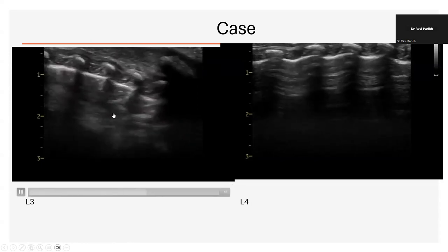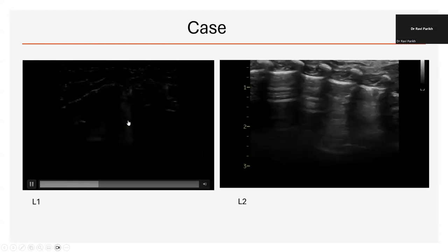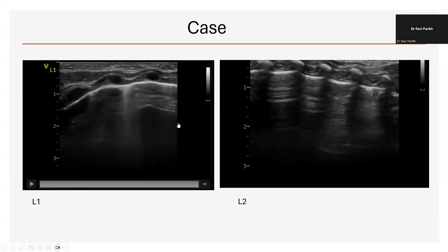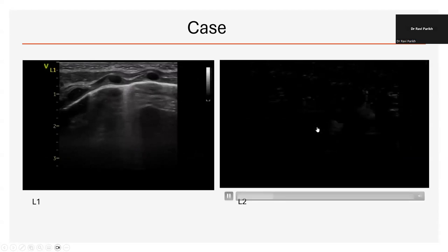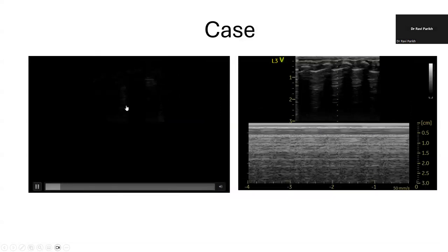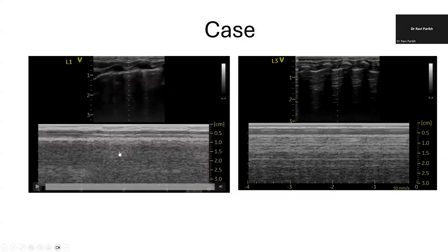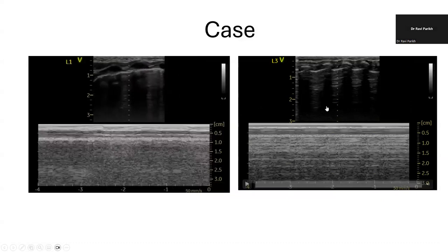Yep. So the left lung, if I summarize and say L5 and L6 were exactly the same, it's relatively well aerated, right? Yeah. Maybe just the left upper zone, a little bit wet, but actually anteriorly, but the rest of the lung is very well aerated. Now, naturally, what we should always do is confirm with M mode. And if you look here, I've got a classical M mode that shows me a seashore sign.